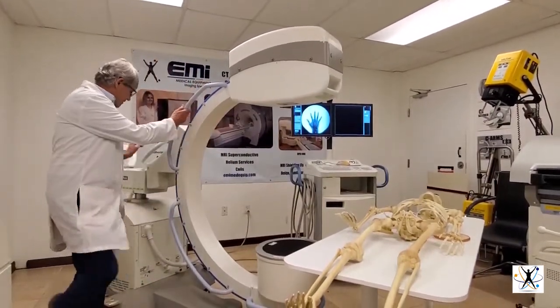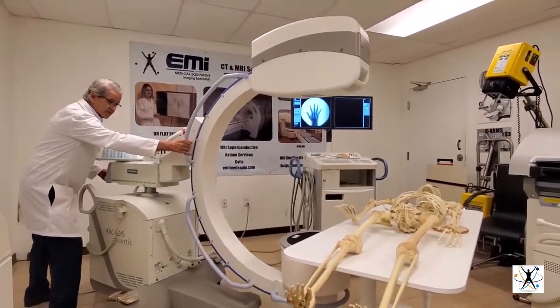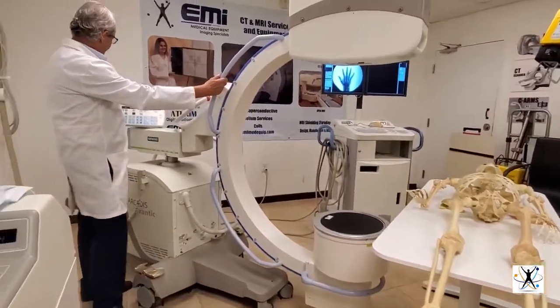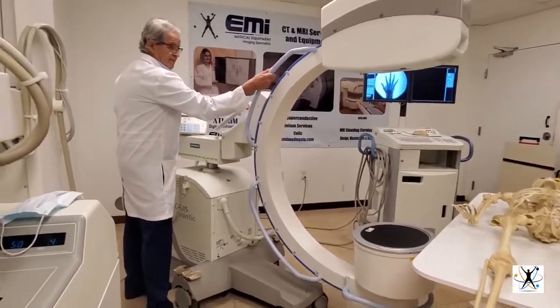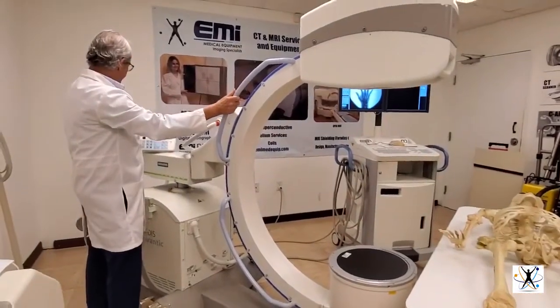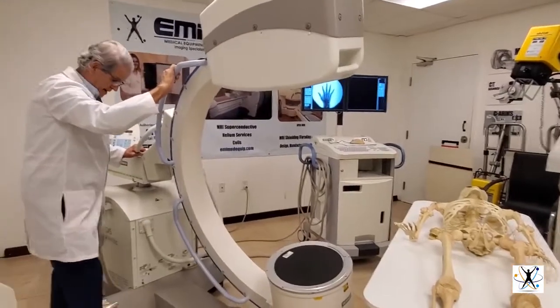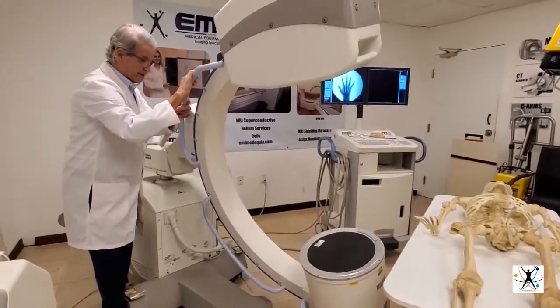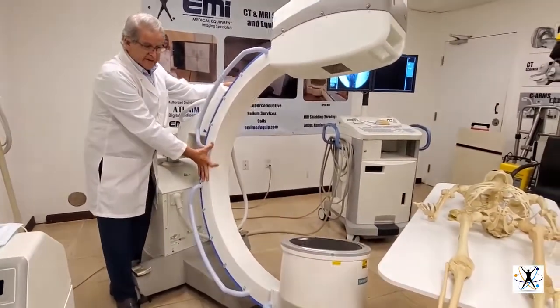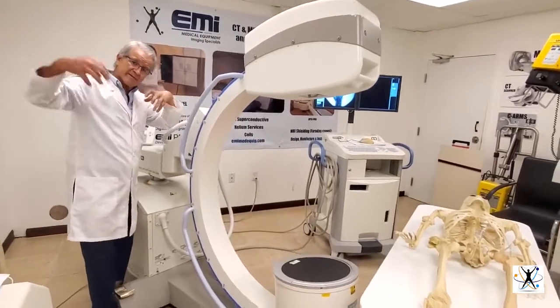These can be moved very easily to the front, to the back, to the side, so you can center the patient and do all kinds of studies. You can also move the angle and rotate the whole thing 180 degrees to see different anatomies from different angles.